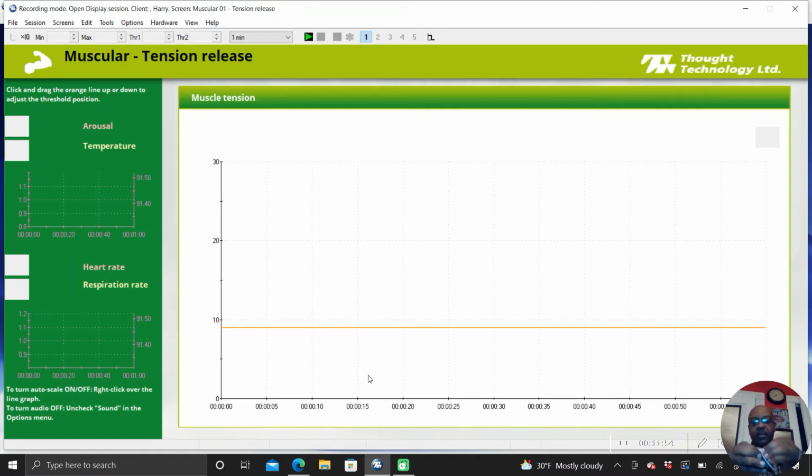And I'm going to peel the backing off. And I'm going to put this directly on the muscle. Just need a little bit more cable here. So I'm going to put this right on my arm. Same place where I already had prepped. And now I'm going to look at the impedance with this setup. This is what this looks like on my arm. So I'm going to see if we get any impedances that look different.